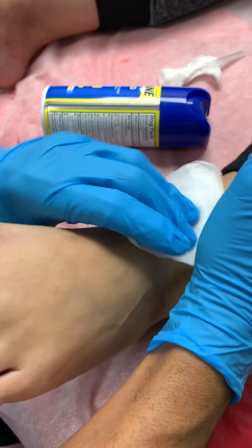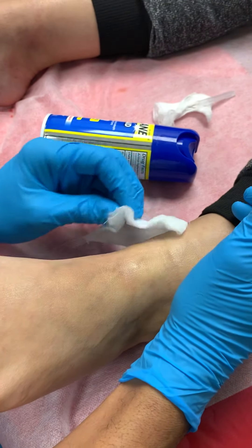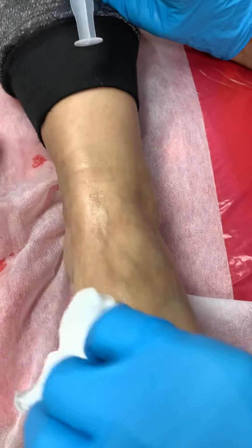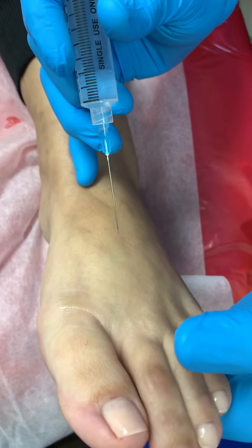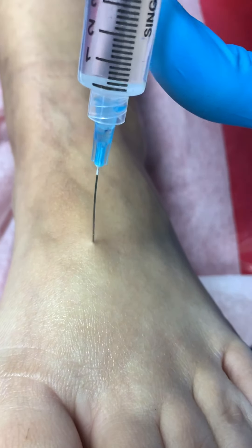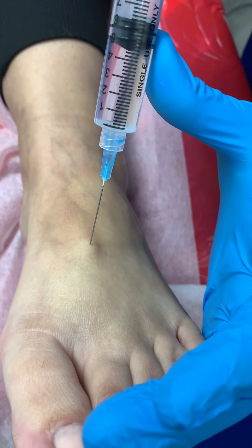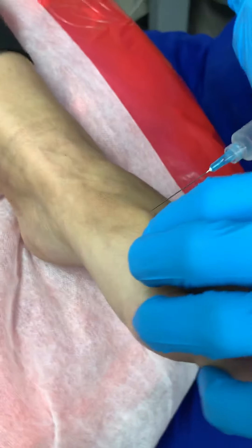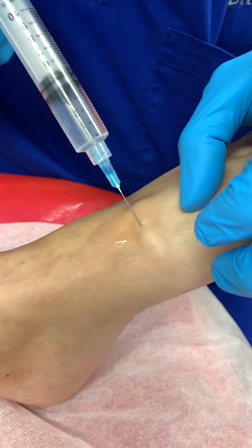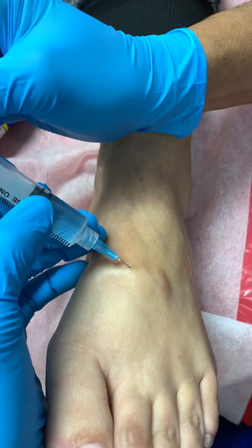He's giving it a little massage to try to move a little bit of the anesthesia to each side respectively. Now there's another important branch, and he's going all the way down because there's another branch down there. The foot is very complex — he's going to pick up another nerve on this side and also the lateral side.